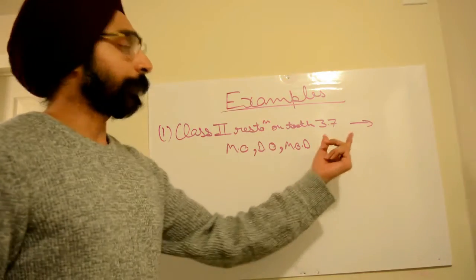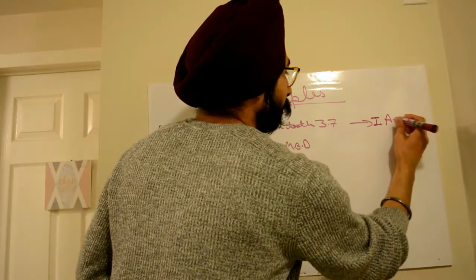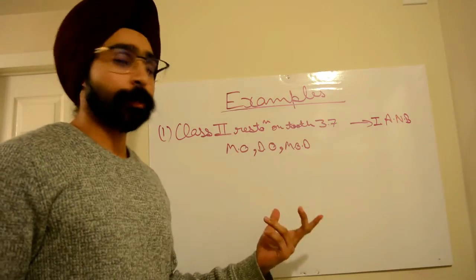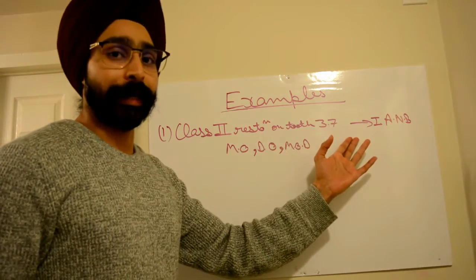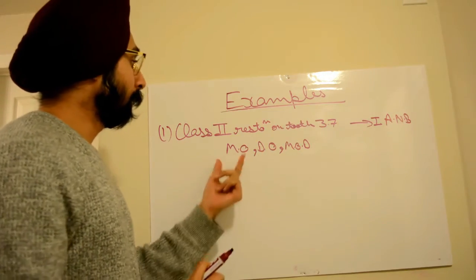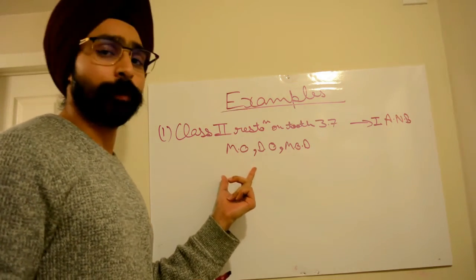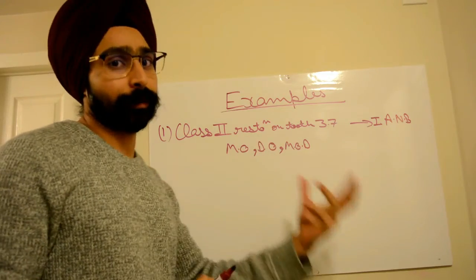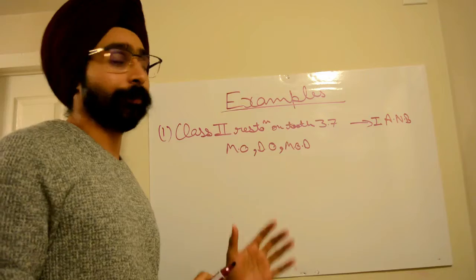The pulp of 3.7 will be anesthetized by inferior alveolar nerve block. But if we want to put the wedge, we need to put the wedge between 3.7 and 3.8 or 3.7 and 3.6. In case the cavities are mesio-occlusal, then we need to put the wedge between 3.6 and 3.7. If it is disto-occlusal, then 3.7 and 3.8, and if it is MOD, then between 3.6 and 3.7 and 3.7 and 3.8.